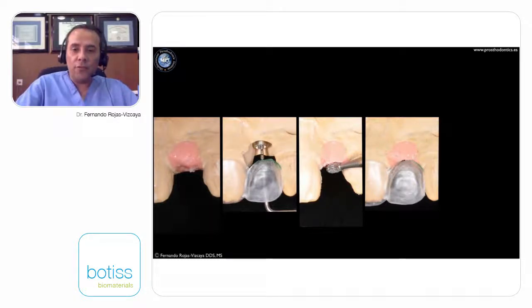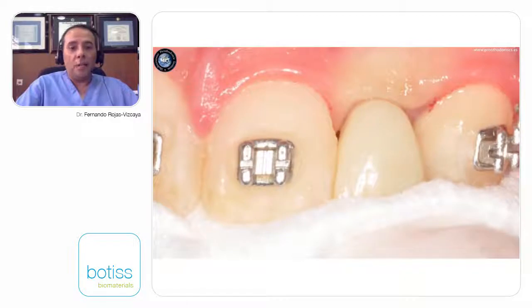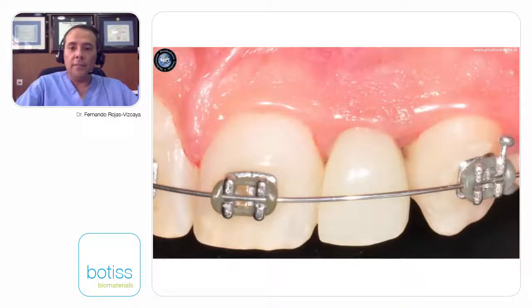Once I cut the soft tissue until it matches the planned crown, it is because both the margin of the crown and the soft tissue are at 3 mm from the implant. When I make a crown on this new master cast, I can go to the patient, compress, and what happens?